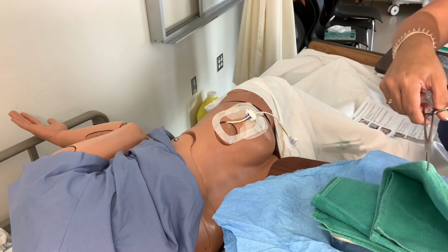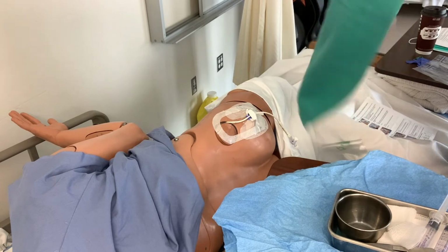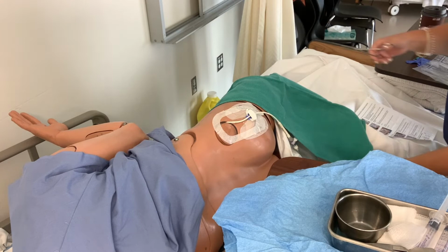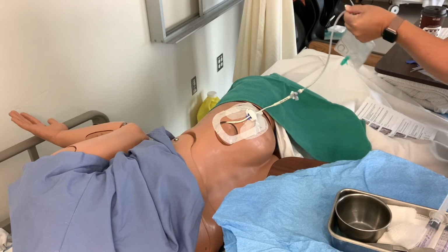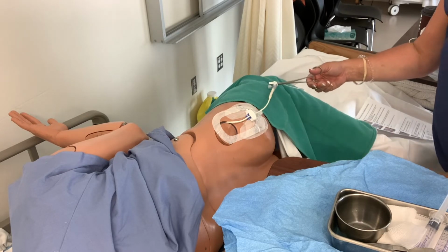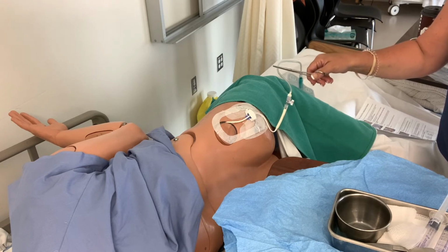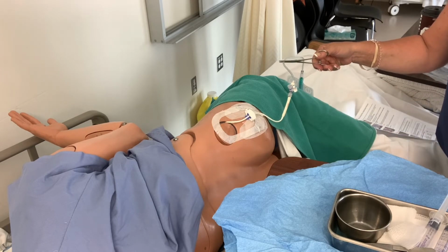I'm going to lift up my sterile drape, and I am just going to place it right here. And I'm going to pick up, and I can do that with my bare hands because this is in the bed with the patient anyway, and I can wear blue gloves if I want, but I'm going to place the connection port or the stopcock. So I know you're kind of far away from that, and hopefully I can lift that up so that you can, I'll put it against the green towel.